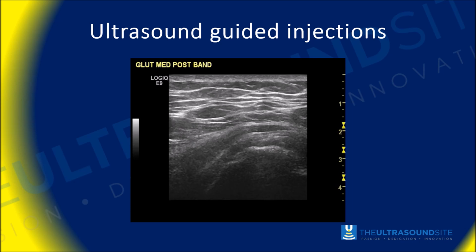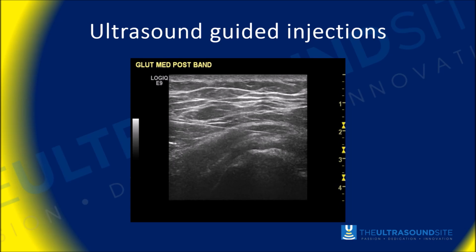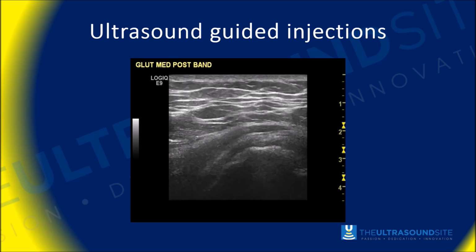Much is made of the additional accuracy, and obviously that is a very significant part of performing an ultrasound guided injection, but we've got to consider everything that we can see on that screen, so we can see the context within which that injection is being performed. We can see what is there, but also what isn't there, and also the actual journey of the needle, so we can be sure that the needle did not go through any structures that we wouldn't have wanted it to go through.